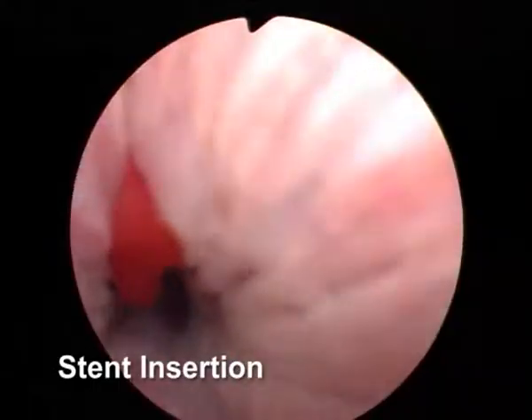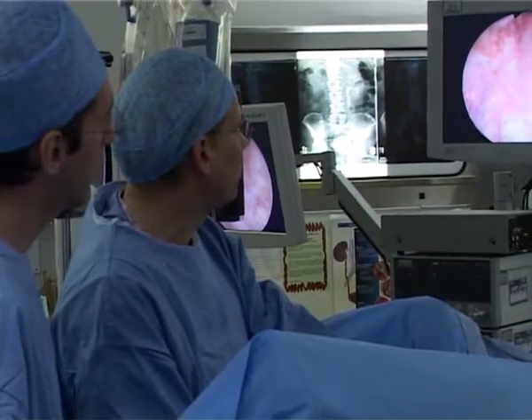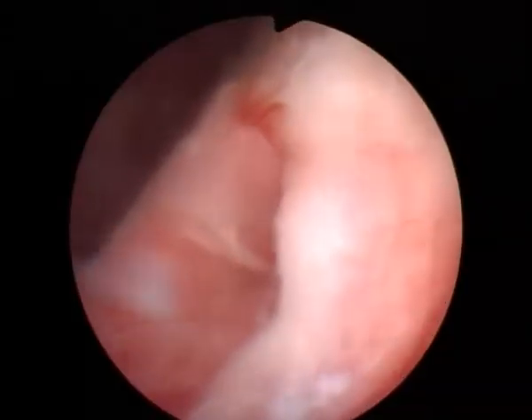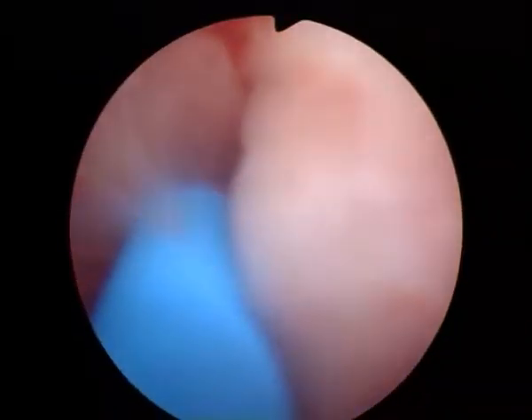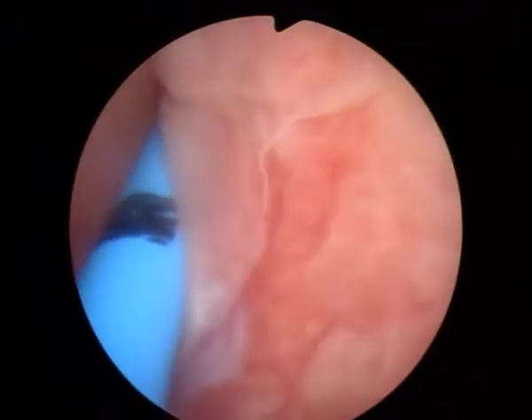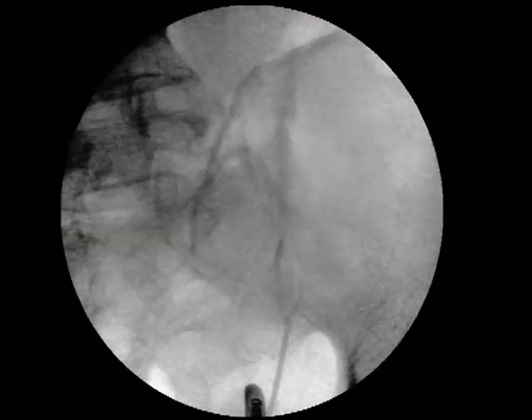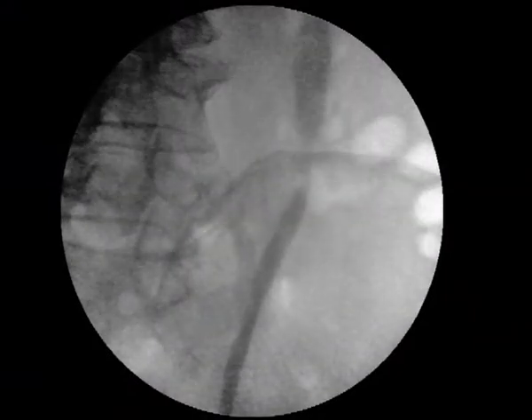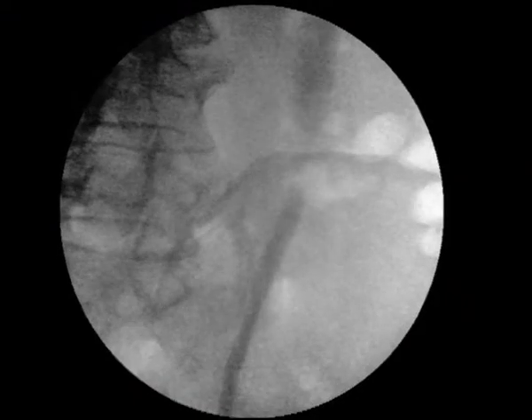For stent insertion, a standard cystoscopy is performed, the ureteric orifice is identified, and a standard ureteric catheter is inserted into the distal ureter for retrograde ureterography. The stricture's location and length is visualized, and this picture is frozen on a second X-ray monitor.